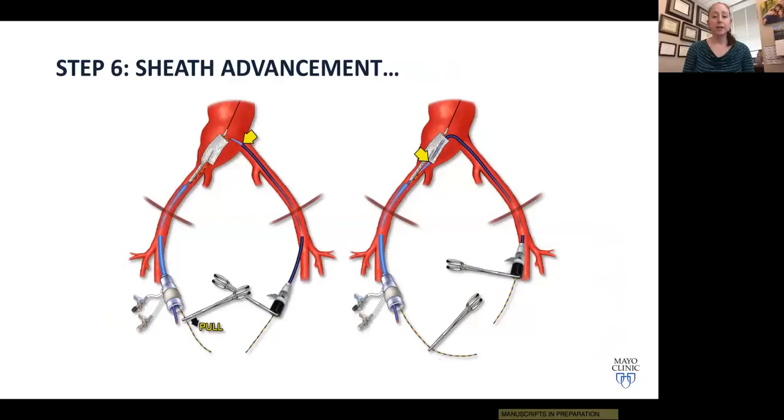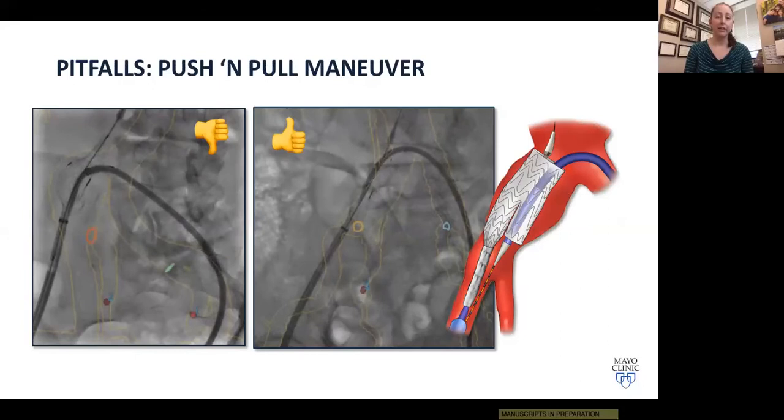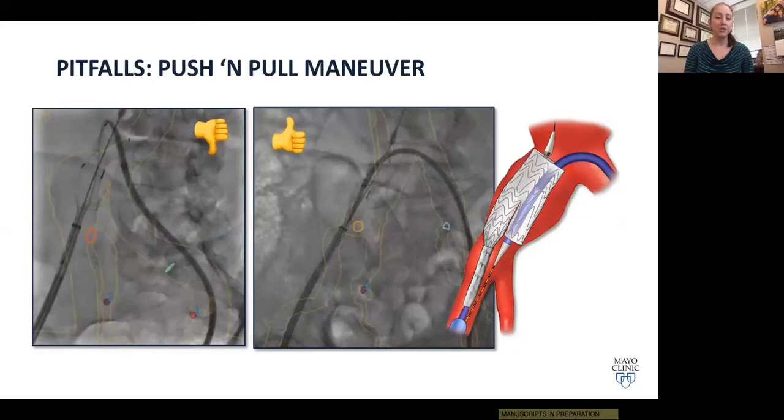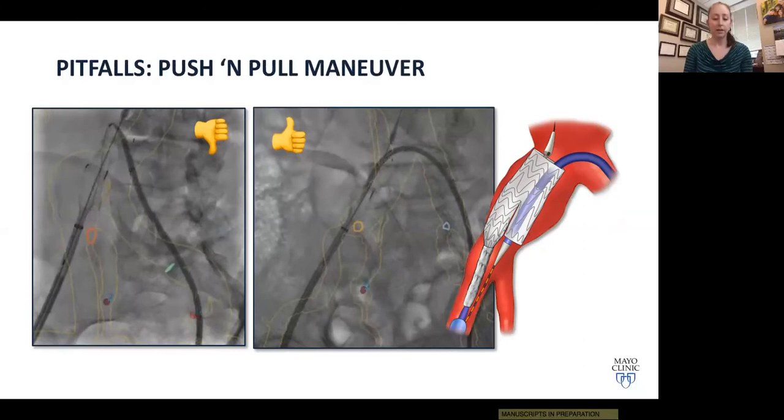In step six, we advance the contralateral sheath up and over the aortic bifurcation into the device over the through-and-through wire. The key maneuver here is to pull rather than push. On the left, you can see what happens with too much pushing and not enough pulling — buckling of the sheath and potential displacement of the device body. If you pull from the ipsilateral side, you get a much smoother advancement up and over, and it saves time as well.